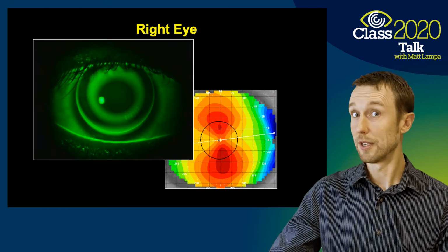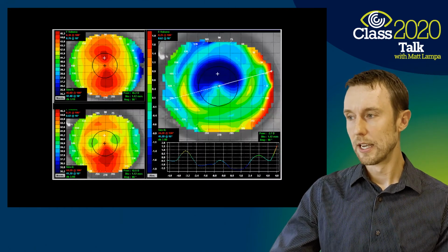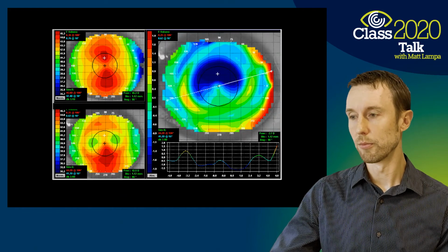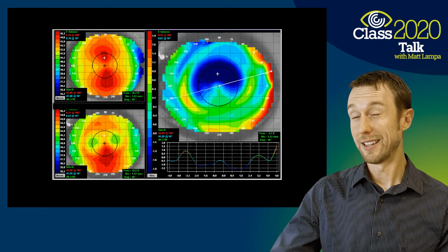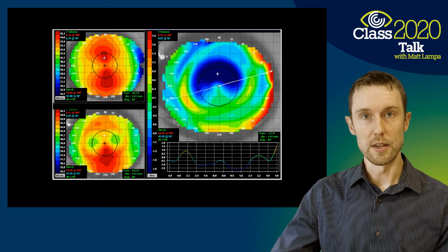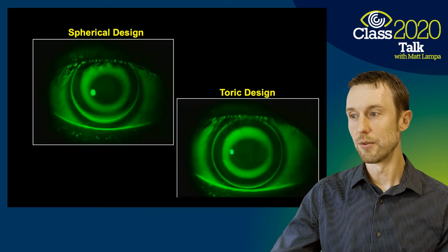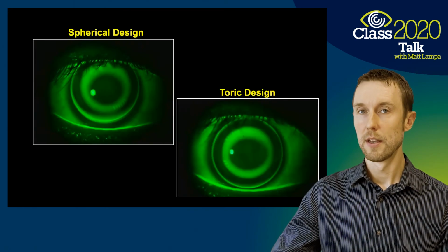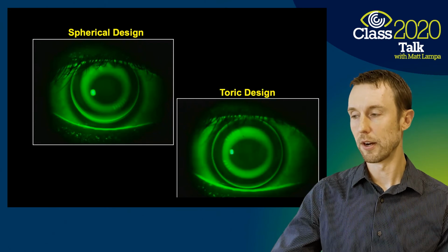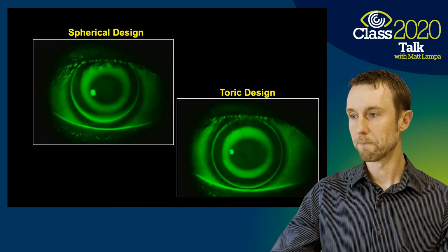Well, let's just see what happens in an overnight trial. Well, unfortunately, that lens moves along the vertical meridian. We really get some decentration. Unfortunately, we don't get the astigmatism to be fully corrected. And what we would need to do is actually better align that eye with a toric orthokeratology lens, differentially treating the reverse curve and landing area of the contact lens horizontally versus vertically.